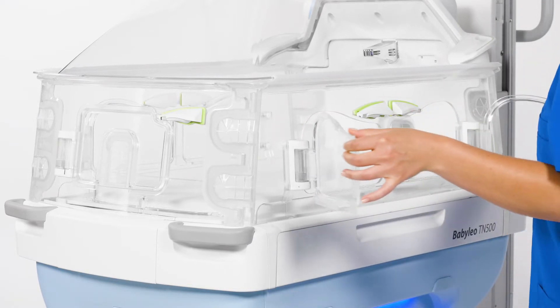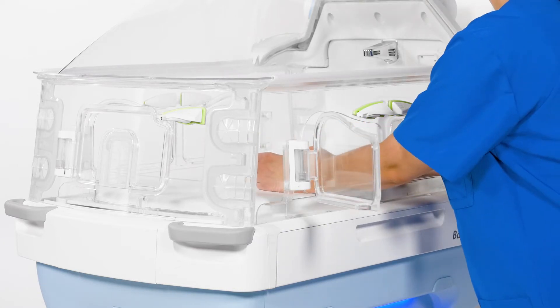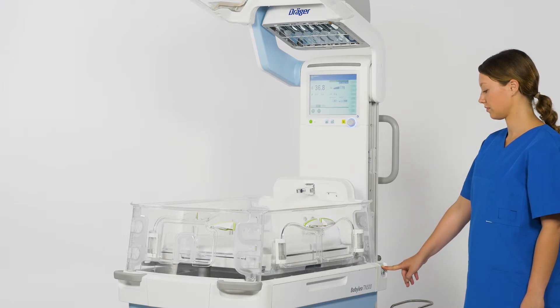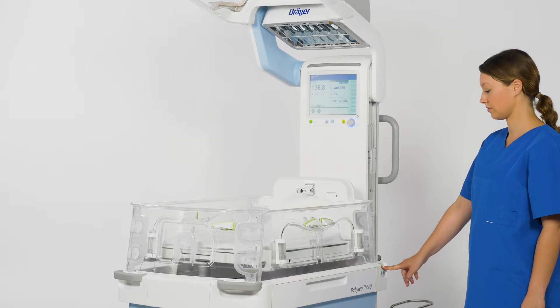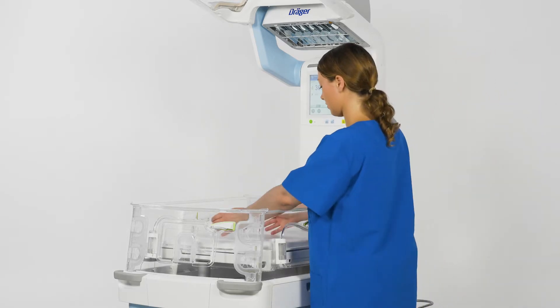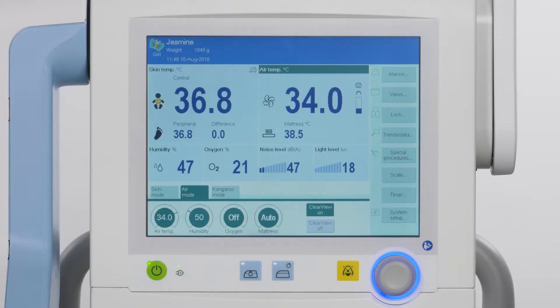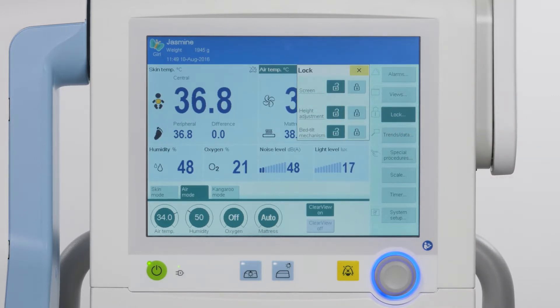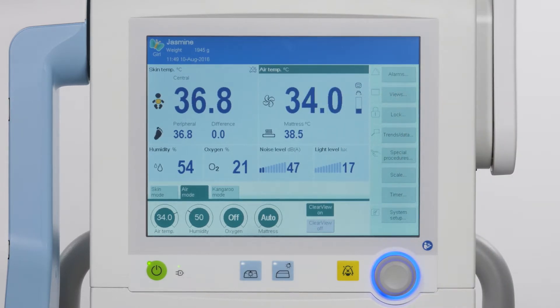In incubator operation, set the lowest position for the mattress tray so that there is as much space as possible for the patient. This position also offers good access to the patient. In radiant warmer operation, Dräger recommends setting the highest position for the mattress tray. This position provides the most effective warming for the patient, while also offering good access. To lock the screen, height adjustment and bed tilt mechanism, touch the lock button on the main menu bar. The right-hand button locks the function and the left-hand button unlocks the function. Please confirm every selection by using the rotary knob. This helps prevent visitors from accidentally adjusting settings.